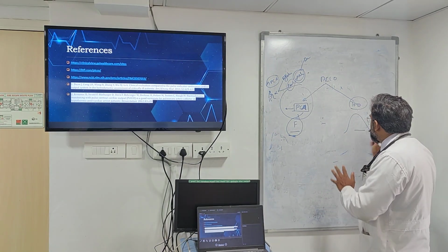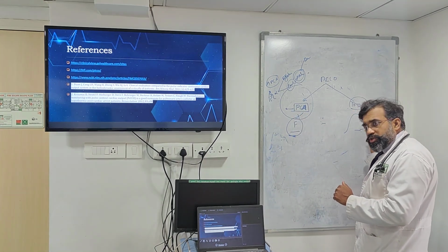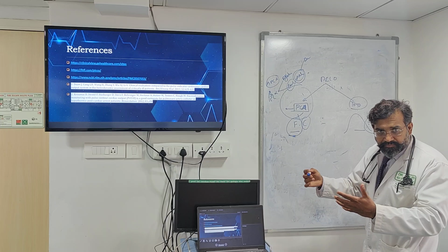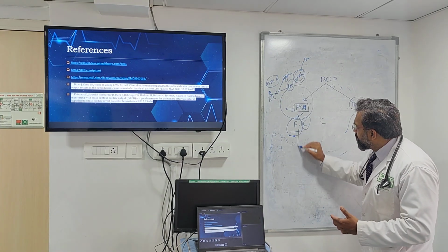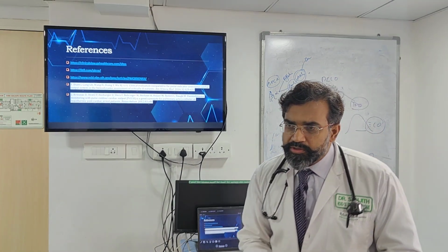Now this is what it is telling you. It is telling you this is the cardiac output I'm getting from thermodilution. Now the monitor interacts with both the mechanisms and then tells you this is what it is. Now you adjust and the computation constant changes depending on this. You understand? And that's why you then have continuous waveform which gives you continuous cardiac output. That's why you start getting those continuous cardiac outputs.